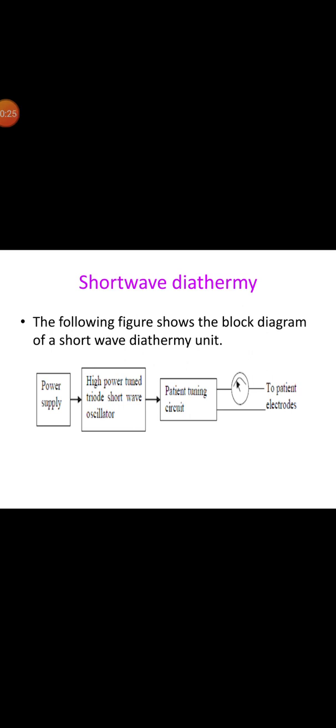Shortwave diathermy is typically used as an alternative to ultrasound when a wider area of heat application is required. We know that diathermy is a therapeutic modality that is most commonly used for joint conditions such as arthritis, and diathermy refers to the creation of heat using electrical pulses. In diathermy, high frequency electric current is delivered via shortwave, microwave, or ultrasound, which is able to generate deep heat in body tissues. The heat can be used to improve circulation and to relieve pain.